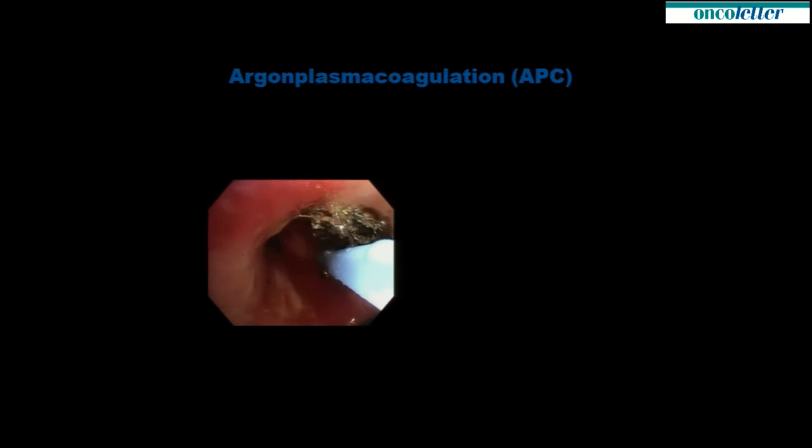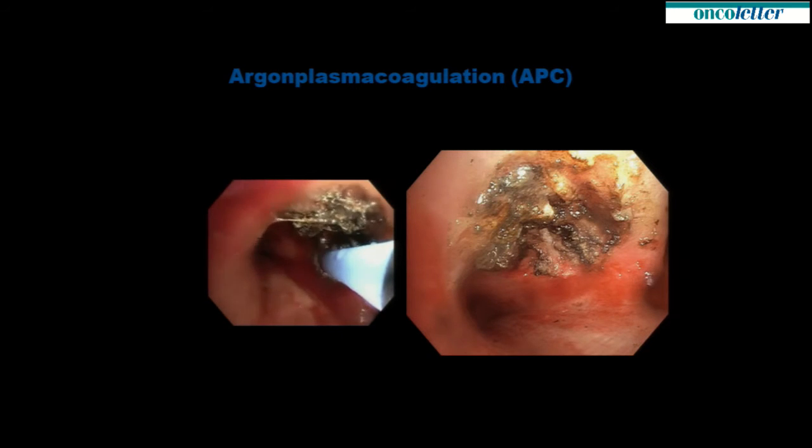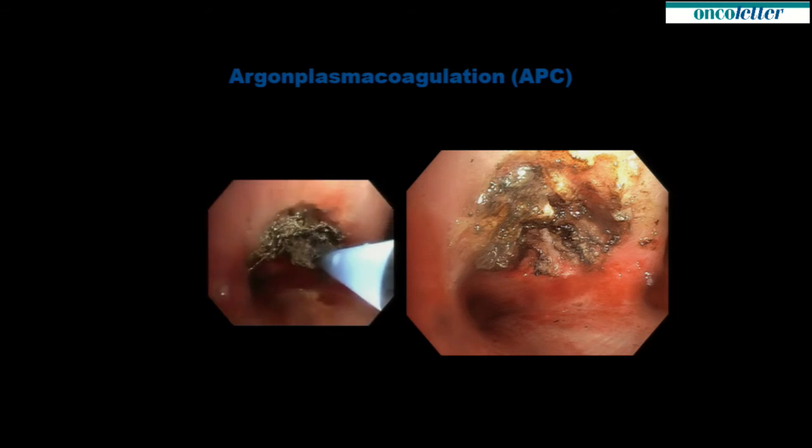It's very important that these patients are ventilated with low oxygen, maximum 40%. Otherwise you have an explosion. So this is the final result, and the patient was happy to not have a cancer. It was a benign tumor.